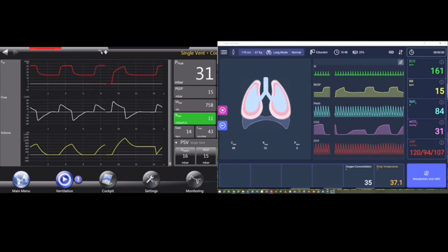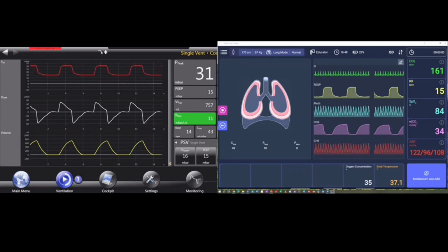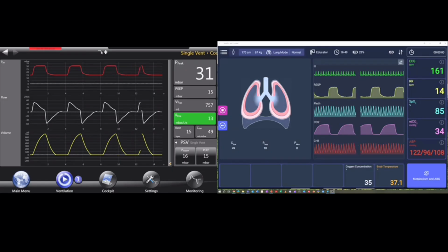And this is autonomous. So whatever you do on the ventilator, when you're doing good, the whole physiological system is reacting to this input, to the increase of mean pressure, to the decrease of mean pressure. So this is all something you are not able to influence directly.